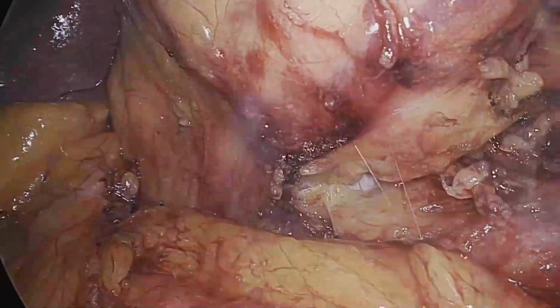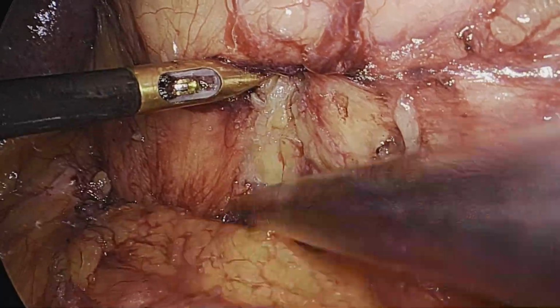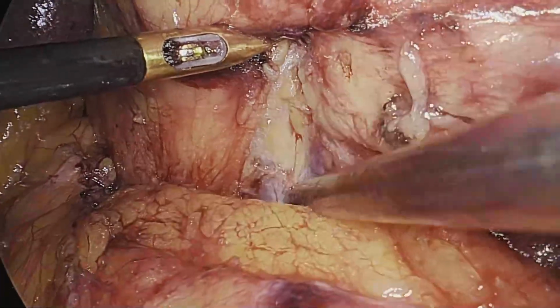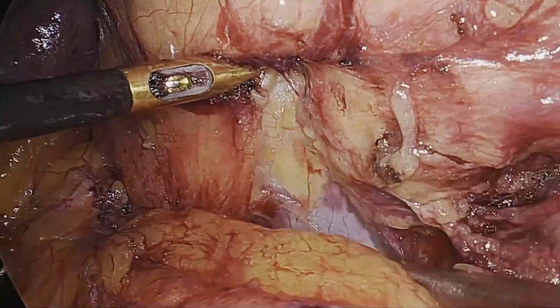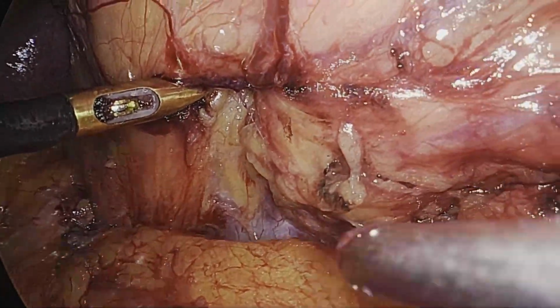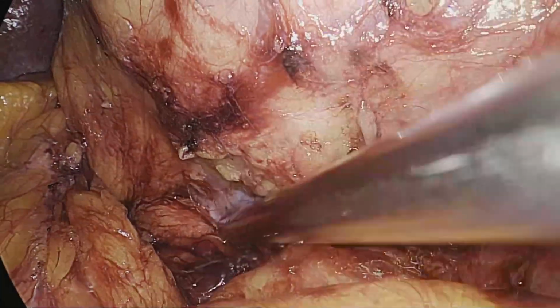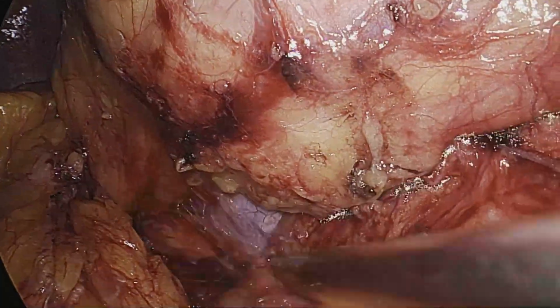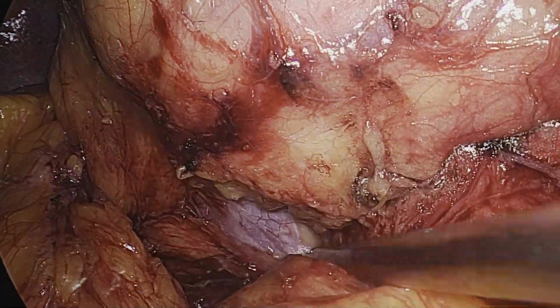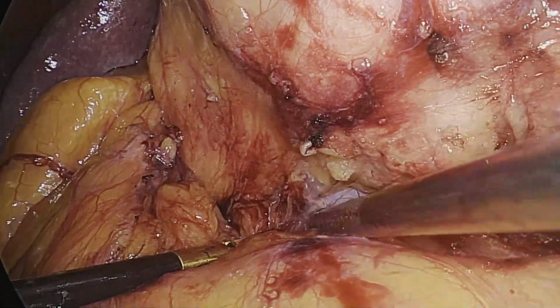Now this blue colored appearance is the renal vein right here. So the fat is being dissected away from the covering above the renal vein, so that the vein can be encircled and clipped later on.